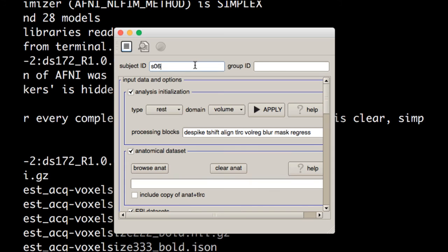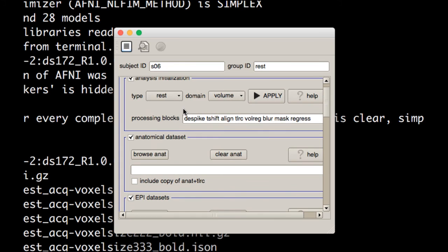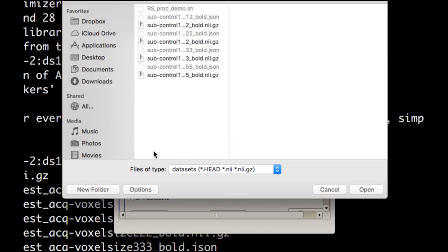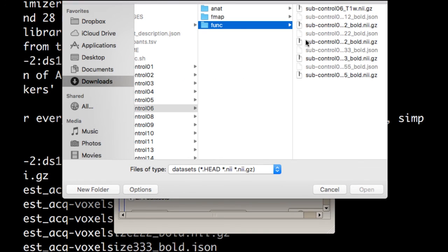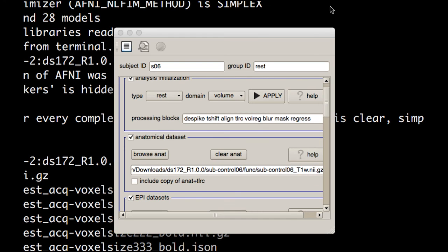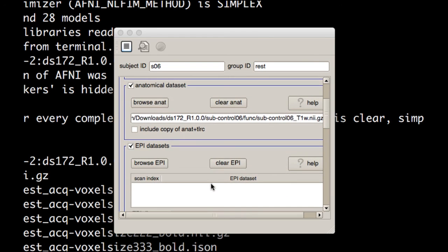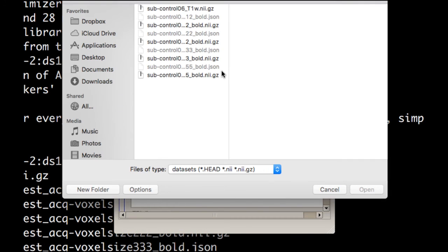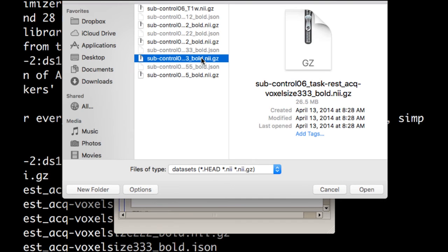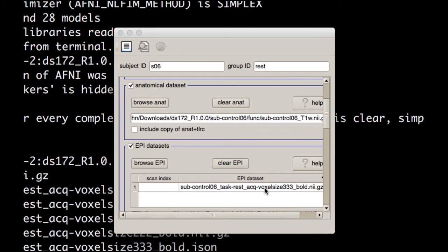I'm going to give it a subject ID of SO6 and a group ID of rest. Those are required, and then I'm going to give it my anatomical data set and my resting state data set. So select my T1W for anatomical, and then for epi data sets, select the 3x3x3 bold data set.